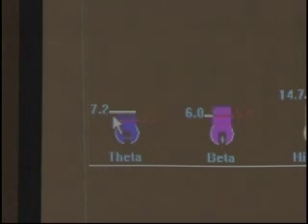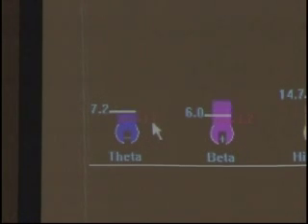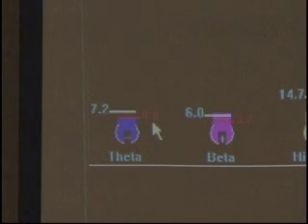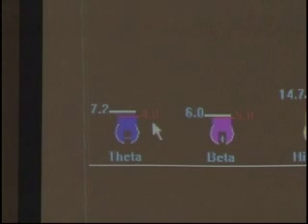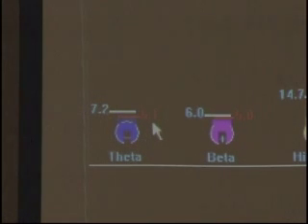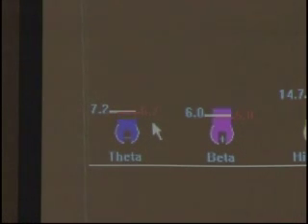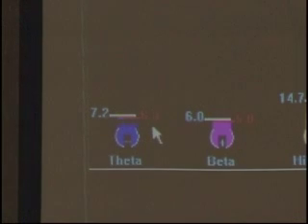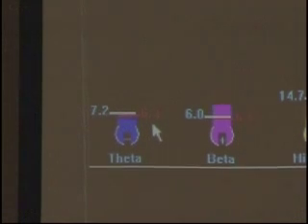Those two numbers have nothing to do with each other — I'll get to that in a second. The red number on the right is telling you, at this moment in time, where the threshold would need to be to meet the target you set. It's fluctuating the whole time. At two minutes what happens is: the fixed threshold and the fluctuating value even up, and then they start fluctuating again.